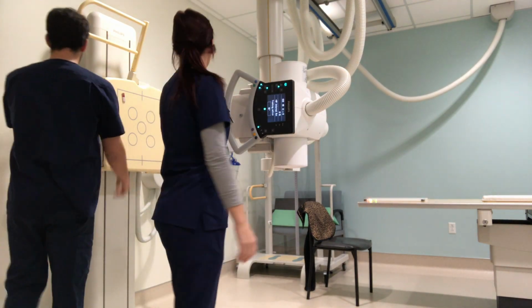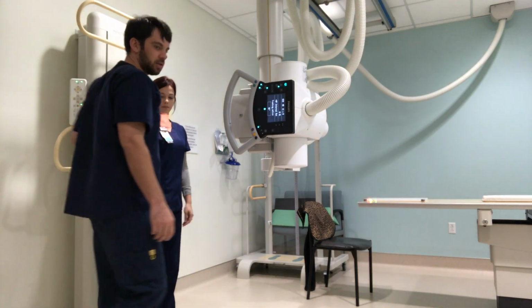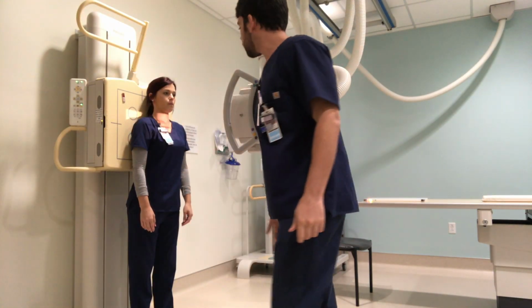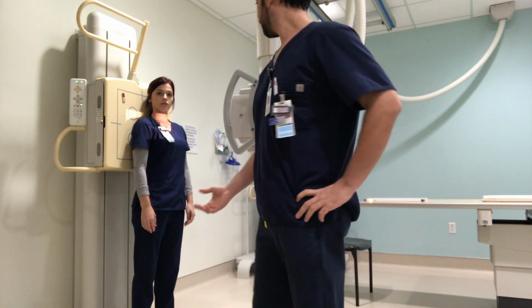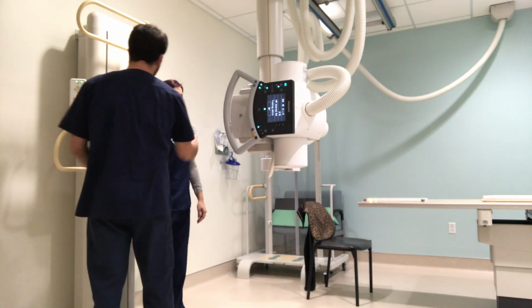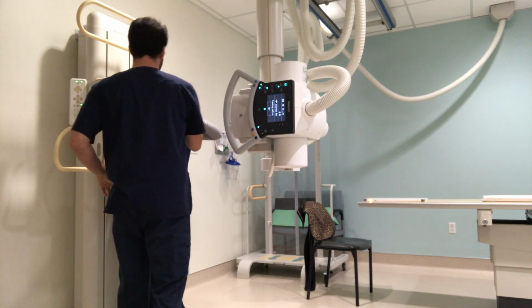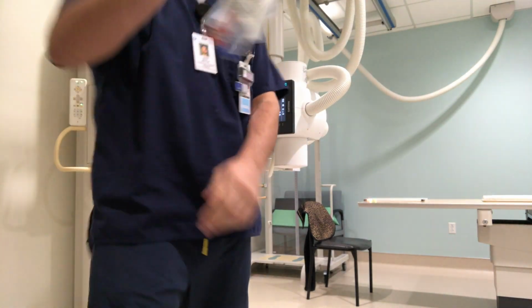All right, for the first picture, can I have you stand with your back against this? First I'm going to start with my internal rotation. Take a little step this way. You're not wearing any necklaces or jewelry? Okay, let's get that out of there.